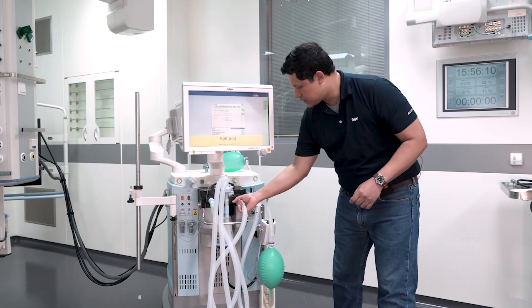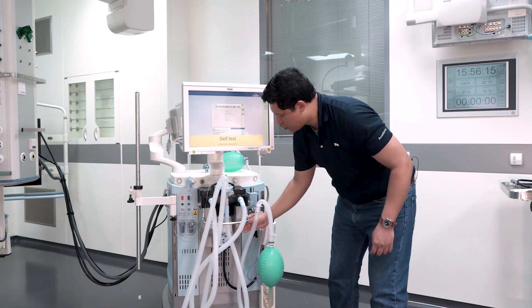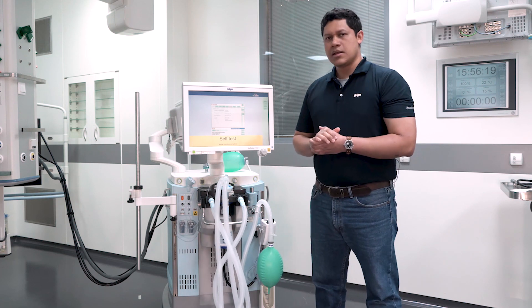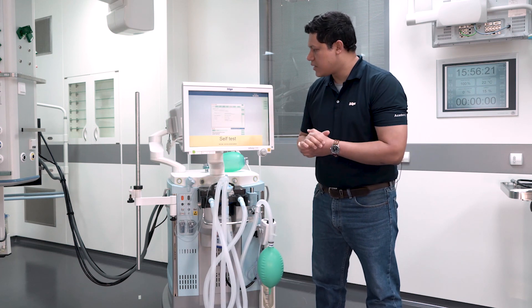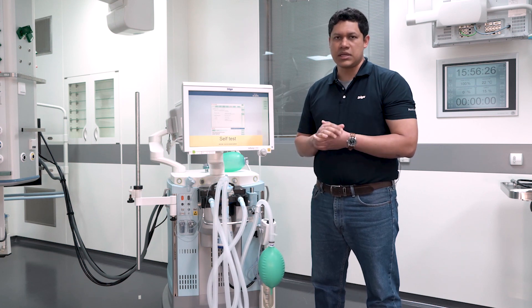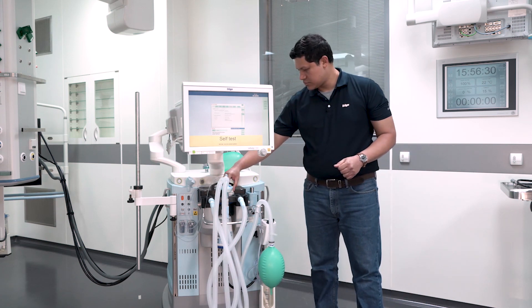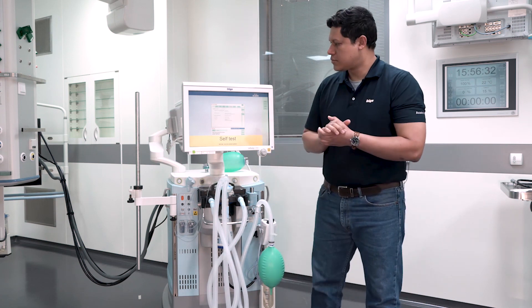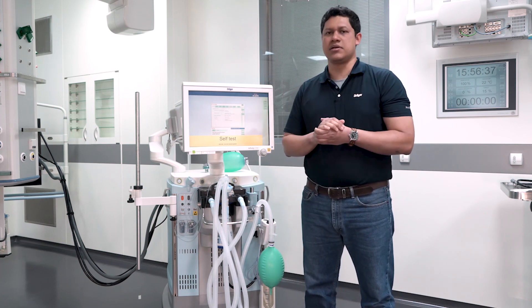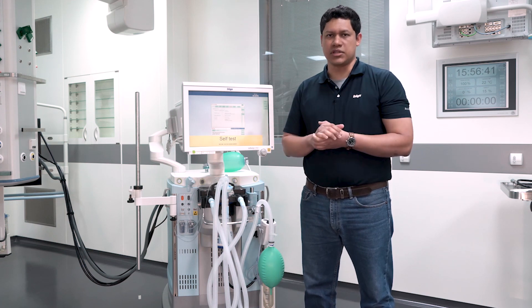Make sure that the breathing hoses are tightly connected and in the right port, including the manual breathing bag. The next element to verify is the APL valve. This should be set in the manual position at the level of 20. The next element to verify is the soda lime canister. You can verify its condition by the color change on the soda lime.